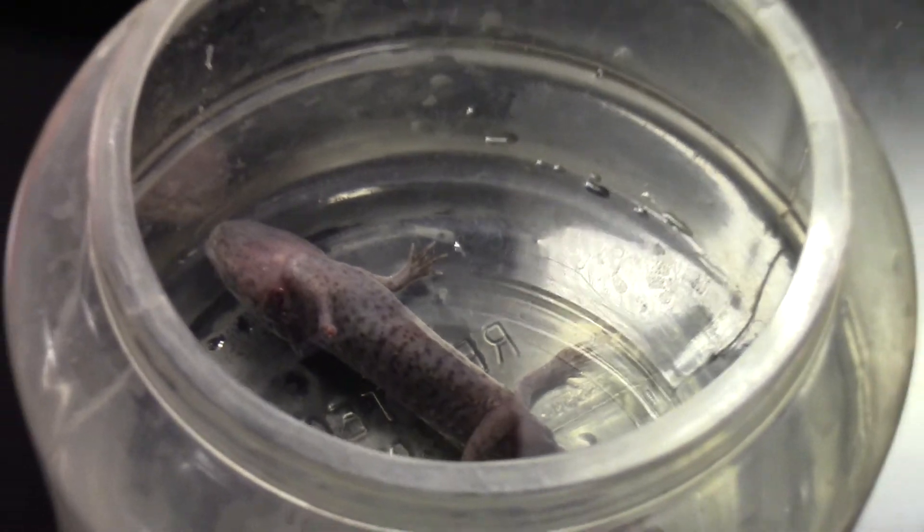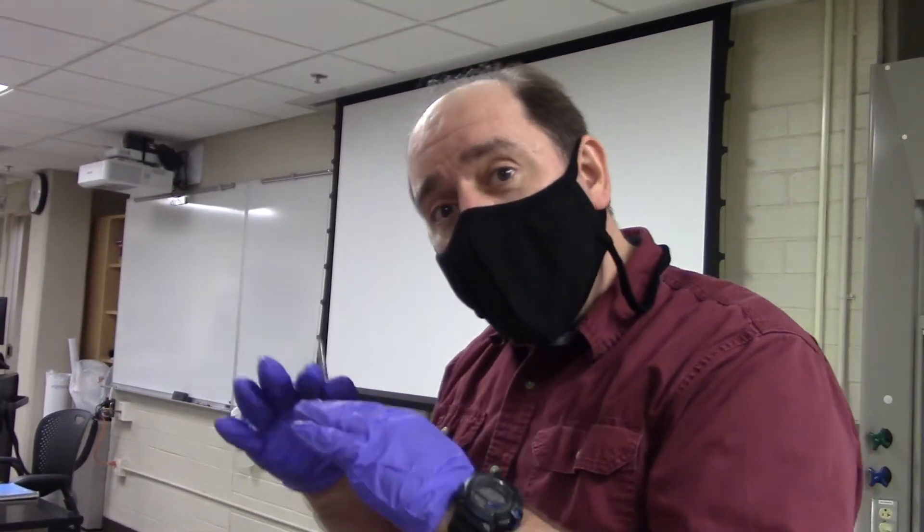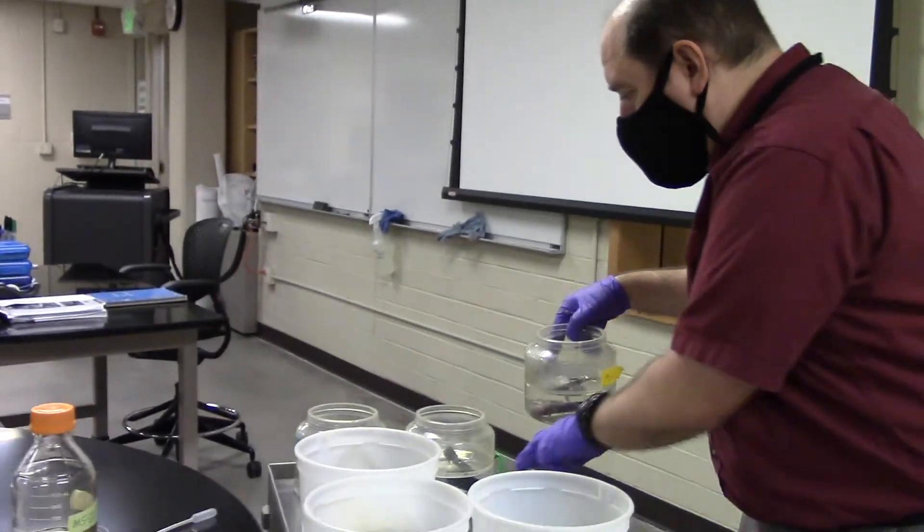So I feel like I was a little bit lucky in terms of my anesthetization this time around. But you know he's going to survive. Anesthetization is a tricky business. If you over anesthetize, the heart actually stops beating, they die. This happens to humans in the hospital as well. That's why anesthetists are so highly sought after. And here we got him just under enough that he didn't feel any of the surgery. Didn't squirm at all. And now back in the water, I'm starting to wake up already.